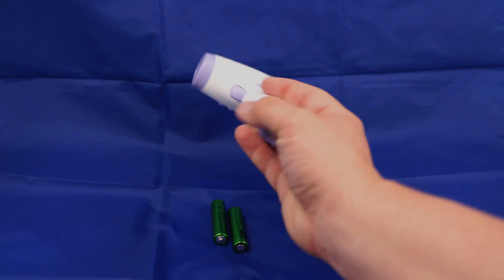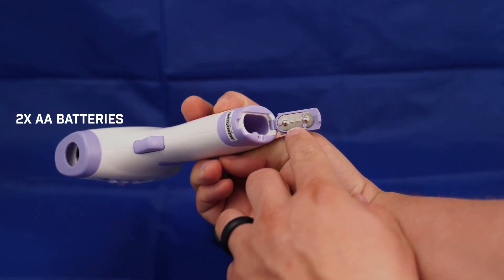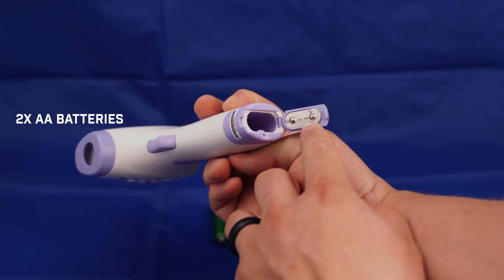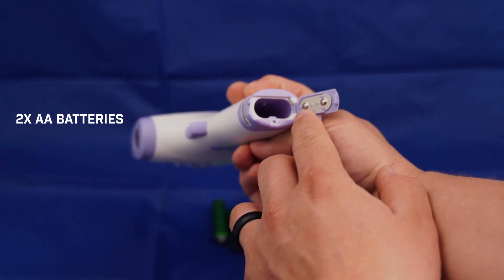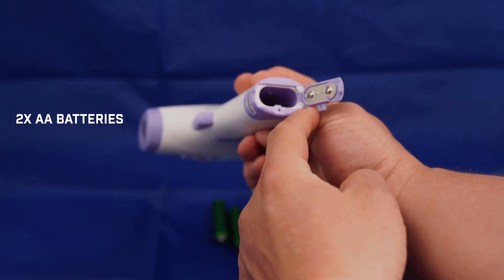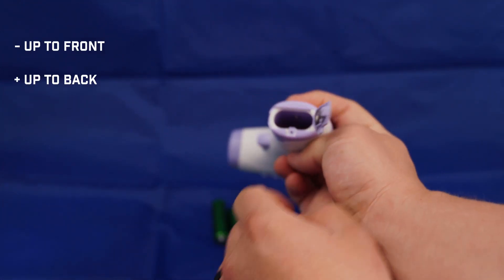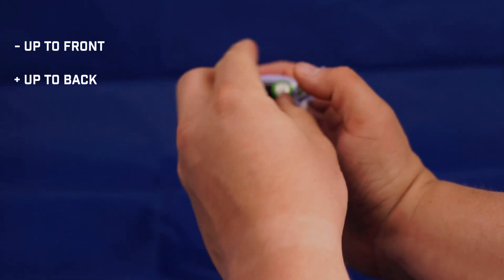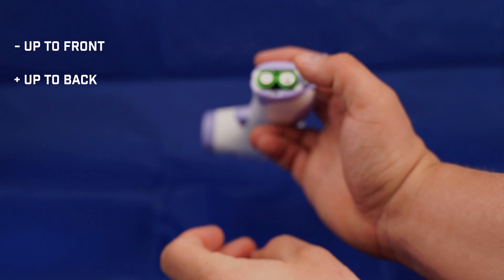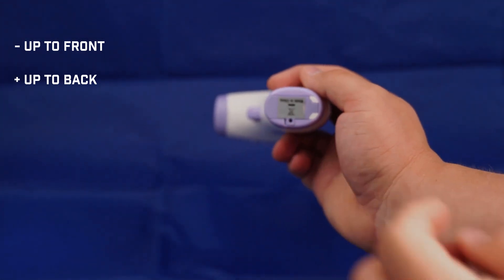To insert the batteries into the IR200, the battery door is on the bottom, and on the bottom of the battery door is a plus-minus sign for battery orientation. The plus or positive side of the battery goes towards the back of the thermometer, and the negative side goes towards the front. Then push down and push in to close the door.